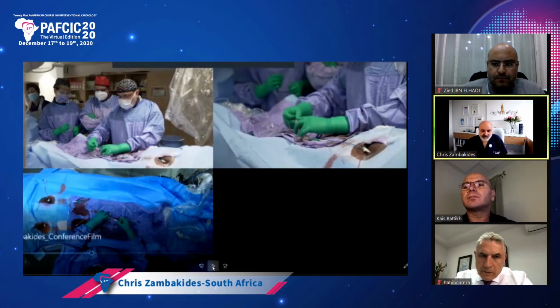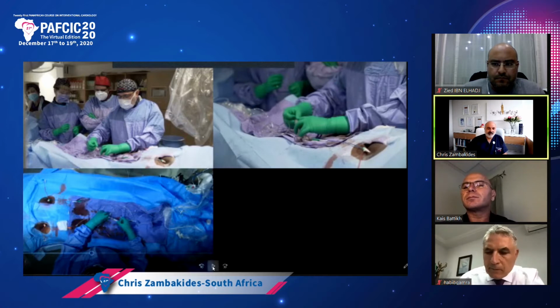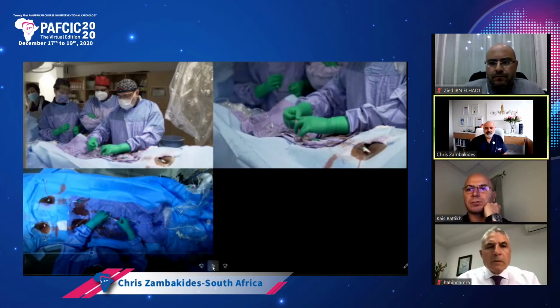I normally will give it five, six, seven minutes of septal surfing, because remember, one of those will join, and you're hoping that by going back and forth and trying to take different septal perforators, you'll be able to join. If you're not able to join, then what we call a tip injection, and that's what I'm going to show you now. That is where you inject through the microcatheter to target which collaterals join, and then you can get into that collateral and try and cross that way.